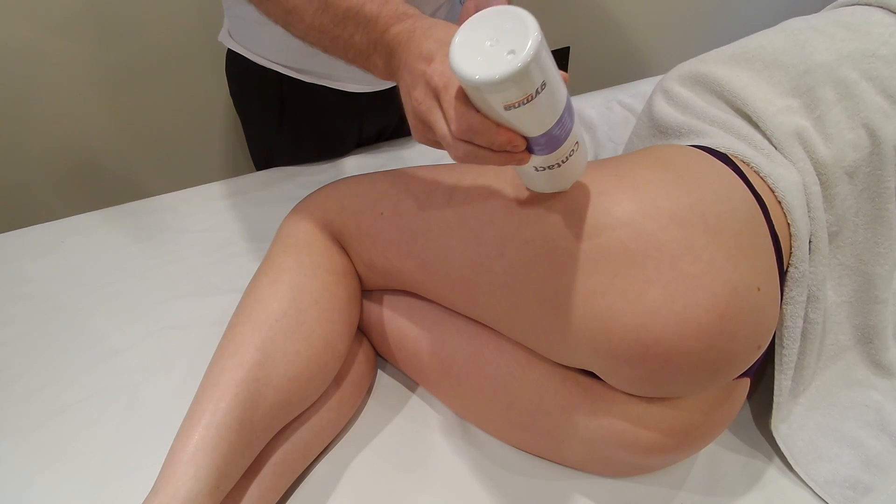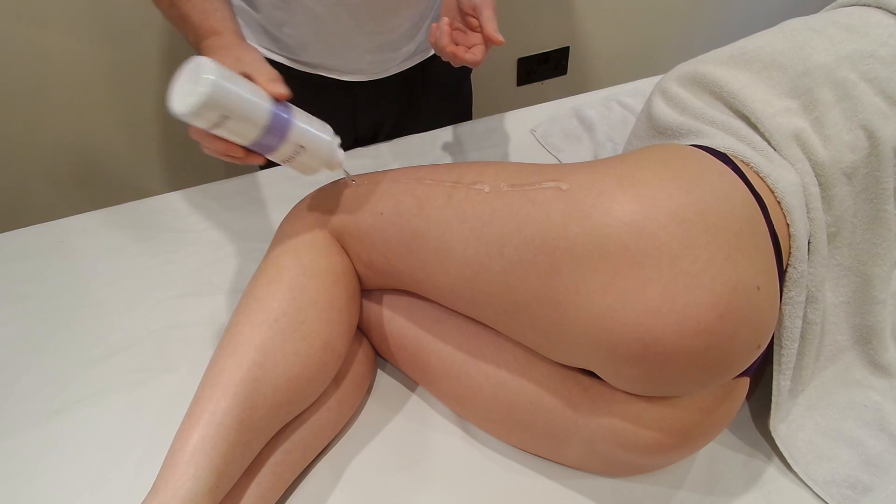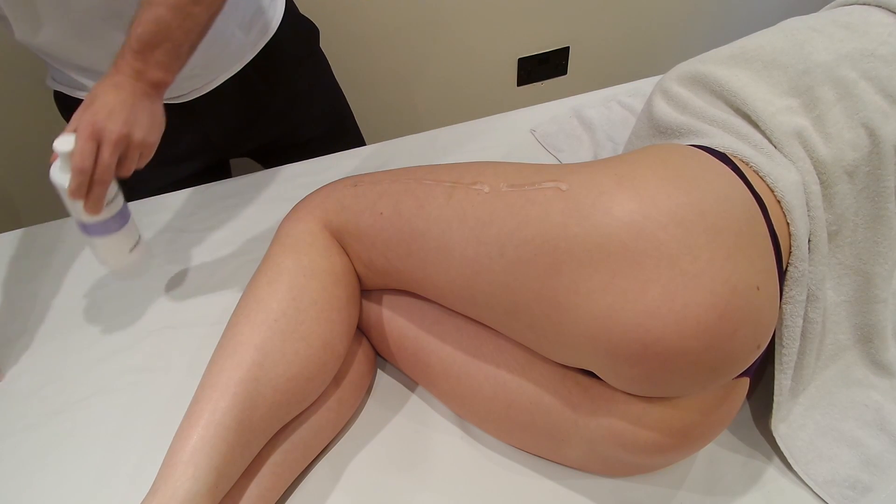We'll come on to the iliotibial band, and we need quite a bit of gel for this. It's a big area and we're going for 3,000 shocks. It's a big head, so we're going to need quite a lot of gel.